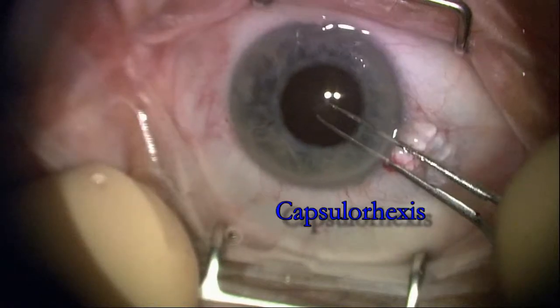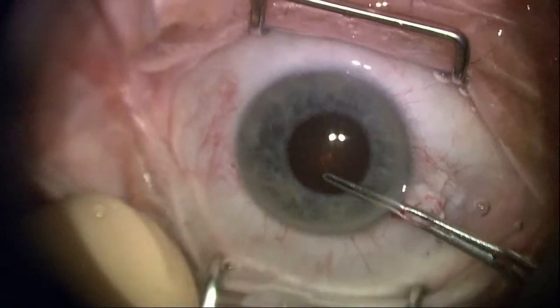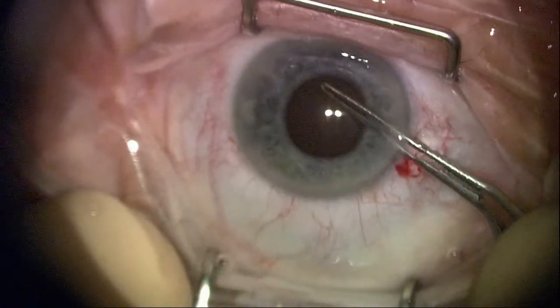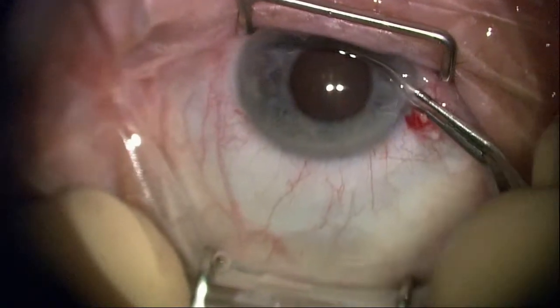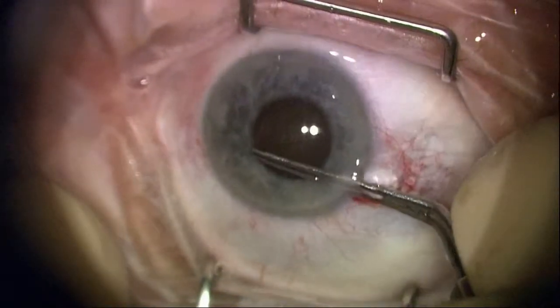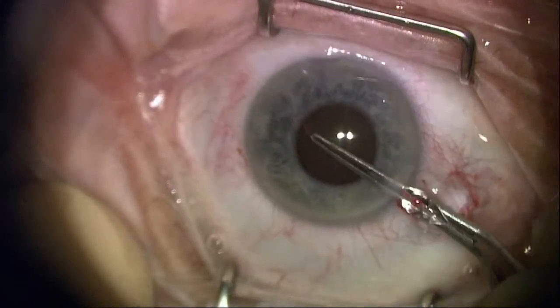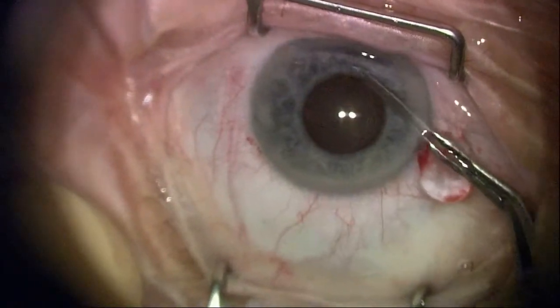You can see here I've got a little bit of dilation from viscomydriasis along with adding epi, but it's going to be pretty hard to maintain a significant pupil size. So I'm maximizing my rhexis — my continuous curvilinear capsular rhexis — to mimic the pupil border.